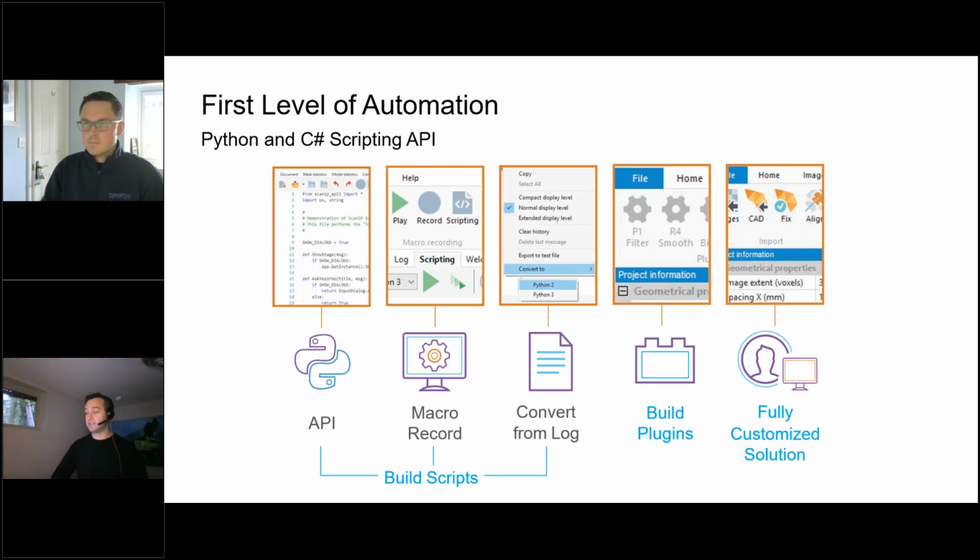You can build plugins within the software, and we have customers who come to us who want specific things customized. If it takes us half a day, we'll just do it for our customers and send them the code. But in other cases, where we have to dedicate an engineer for a week or two to build something, we can do that as well.